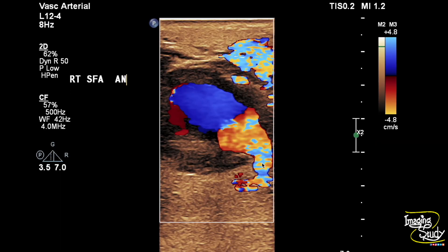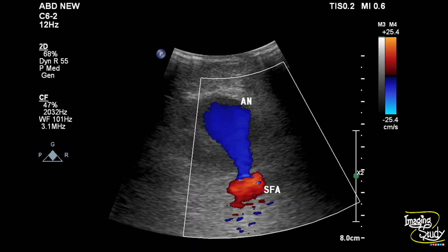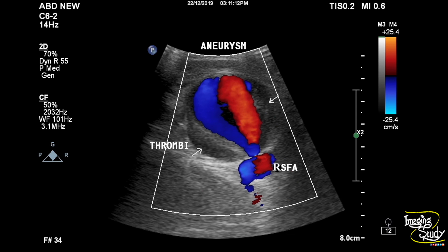Here is the orifice from the superficial femoral artery, and you can see a turbulent flow within this saccular aneurysm. In the curvilinear transducer view, you can see the communication between the superficial femoral artery and the aneurysmal lumen. Another yin-yang pattern from the low-frequency curvilinear transducer view is shown, along with the mural thrombi, which are very common due to turbulent flow within the aneurysm.